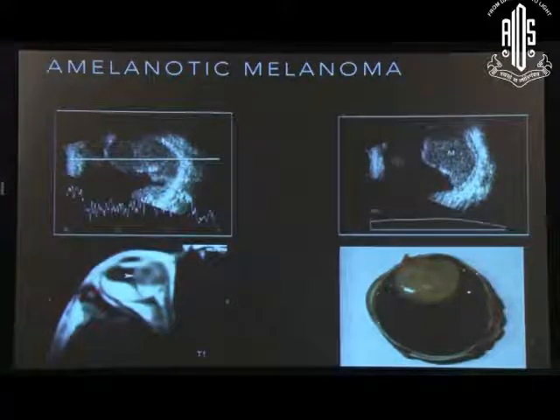And this is the MRI of the patient. It's an 8-year-old, and what is your diagnosis? Anyone? This boy had an amelanotic melanoma of the choroid. So surprises can always come. If you see something like a choroidal detachment, don't always assume it's only a choroidal detachment. Look further. You see this. This is what raised the suspicion. Suddenly a homogeneous structure within the heterogeneous lesion, indicating that this was bleeding from a tumor.